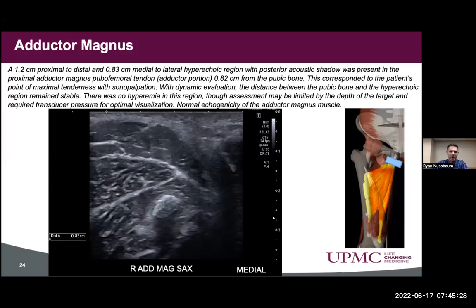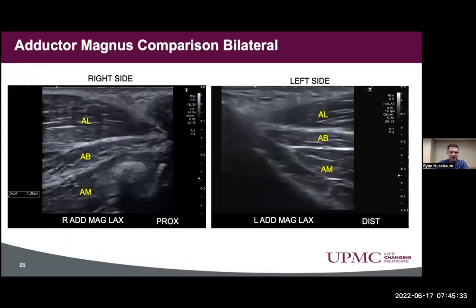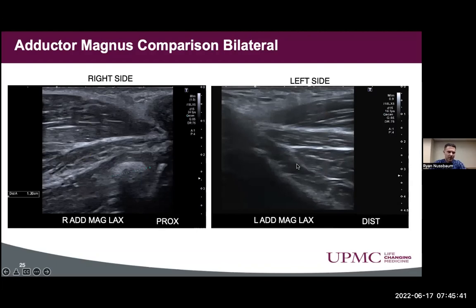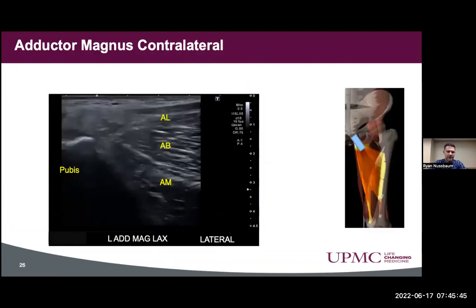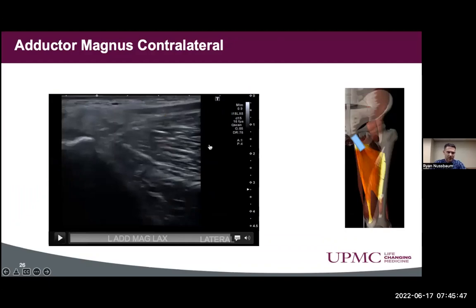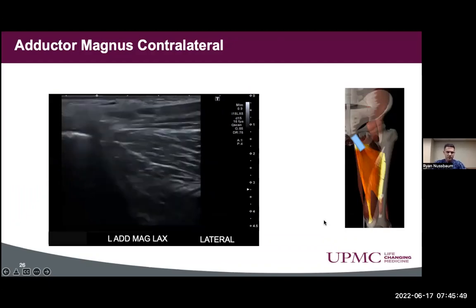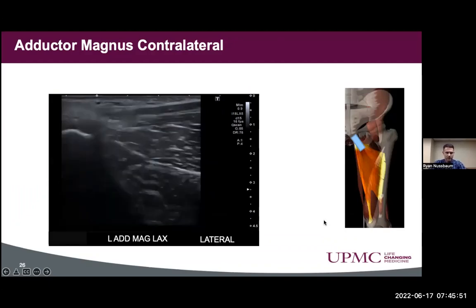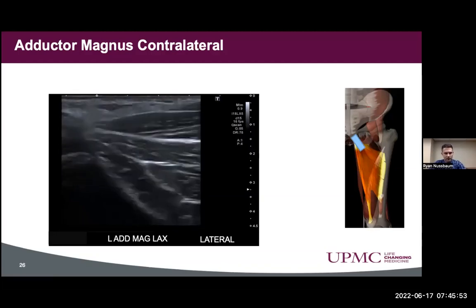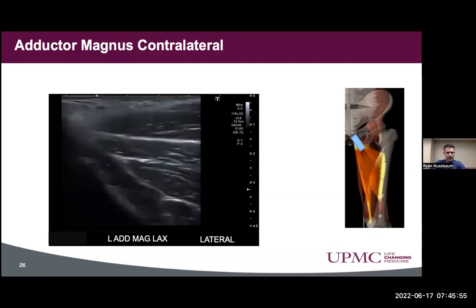We did a comparison study and looked at the left side. We were not seeing any type of hyperechoic structure there. A sweep through the contralateral site also showed no hyperechoic signal being identified.